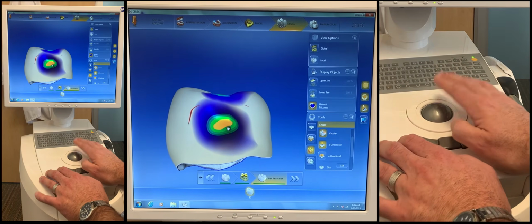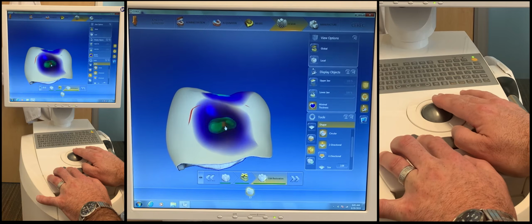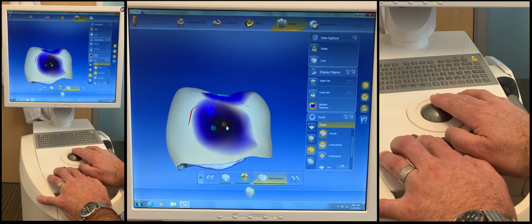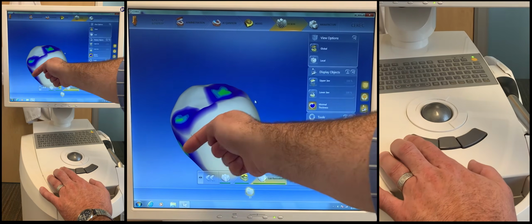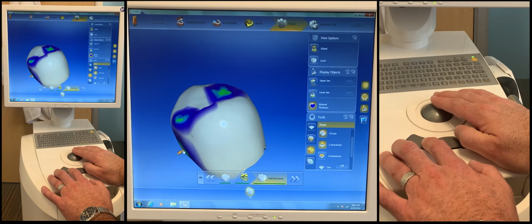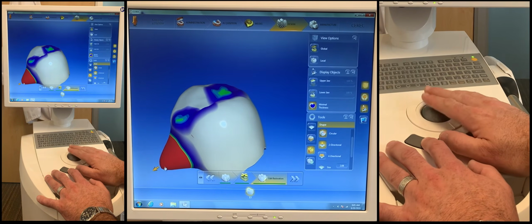So again, I'm using that circular shape tool. I'm going to press and hold and drag up or down. So you can see I can make that contact just giant if I wanted to. But I want a little bit of yellow right there. So if we look at that, you can see it's not jutting way out here. Like if I were to grab this here, I could actually drag that way out. See that? You can drag that way out, which I have no interest in doing.